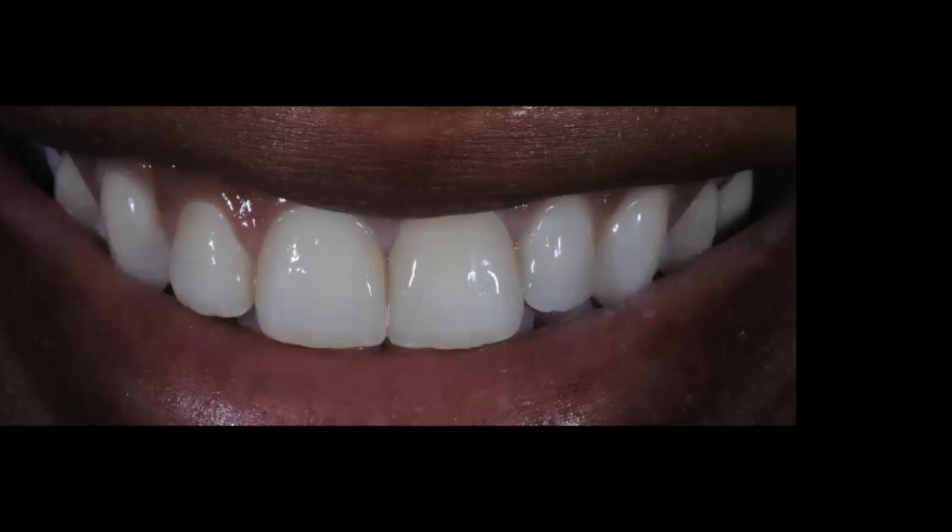Number one: you want to bleach before. Number two: if the veneers are very thin, any color changes in the substrate could affect the final outcome. Can you bleach again after? Yes — on the lingual surface you have tooth structure, so use 10 percent carbamide peroxide with the bleaching gel applied on the lingual surface of the bleaching tray. That should not break down your bonding whatsoever.